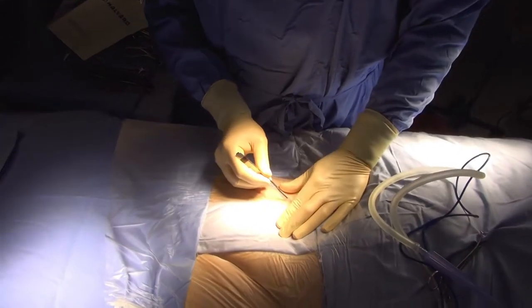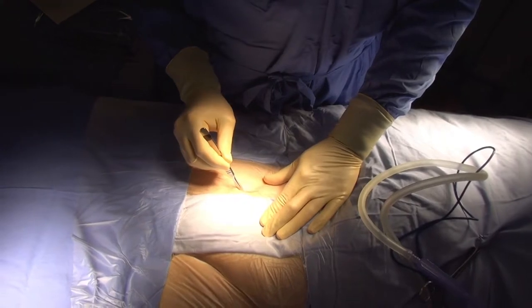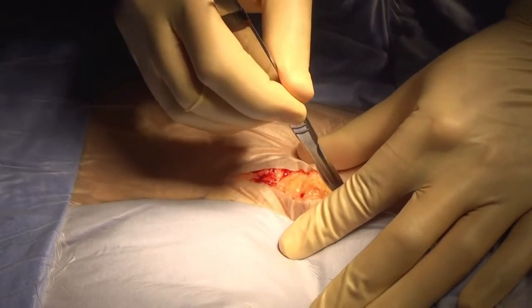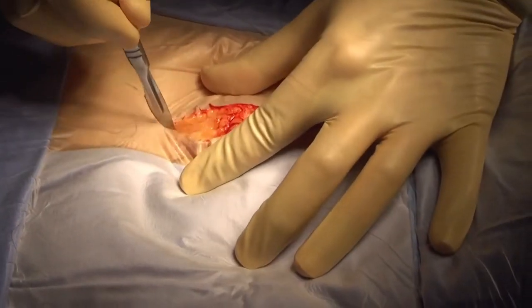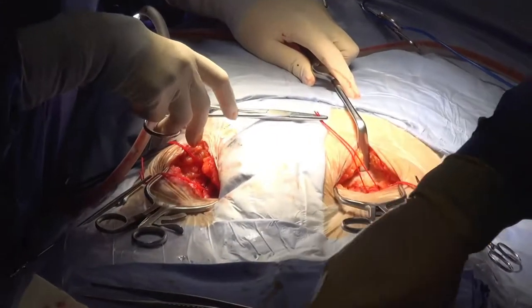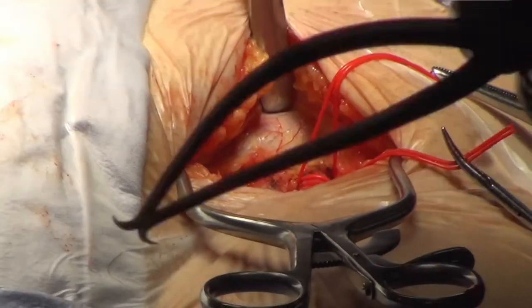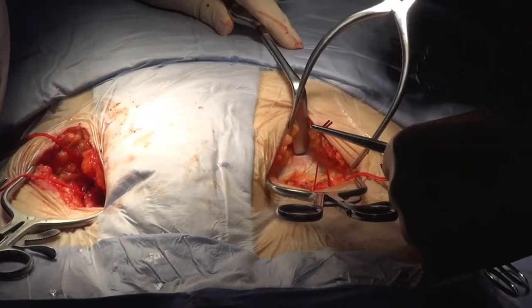The surgery is initiated by making an incision over the femoral artery to allow direct access to the blood vessels where it passes from the abdominal cavity onto the leg. This artery is specifically used due to its large diameter and because it is relatively superficial. After the femoral arteries have been exposed, they are isolated with elastic loops that are used to encircle them. These loops are used to control hemorrhage or bleeding.